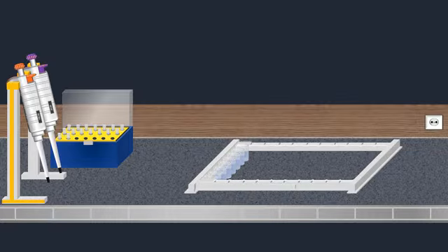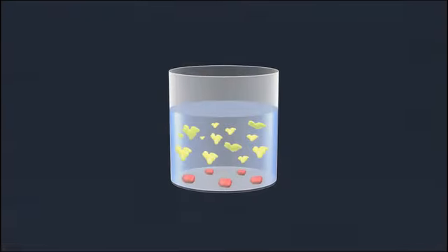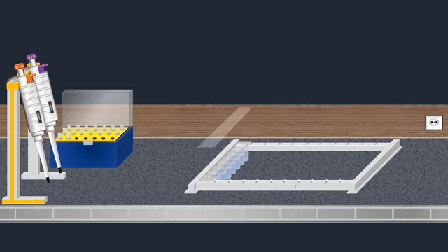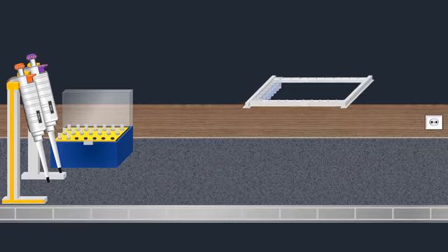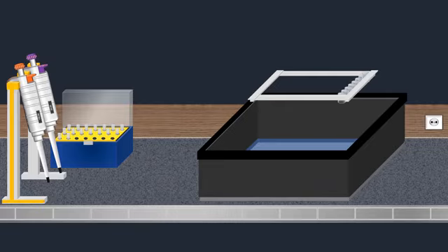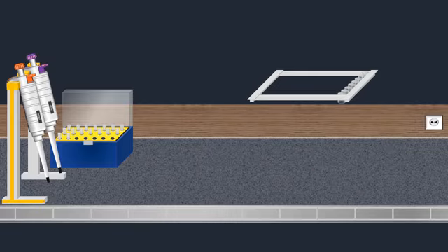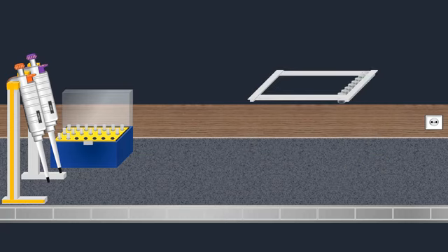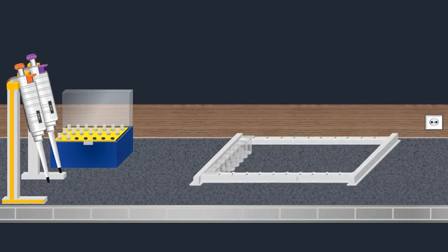The proteins in the blocking solution create a barrier on the plate, preventing the target antibody from binding to these sites in subsequent steps. Once the blocking step is complete, the adhesive plastic is removed. Then the well strip is overturned, allowing the blocking solution to drain out. Next, the absorbent towel effectively absorbs any remaining solution.